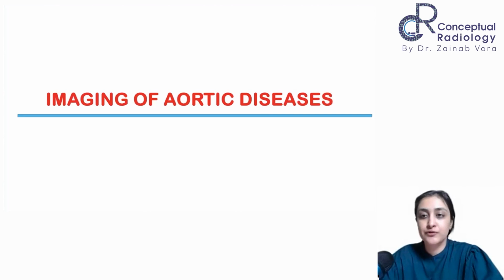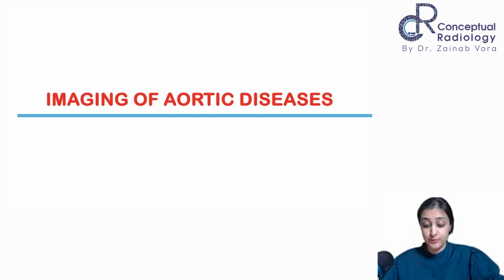So the domain of today's lecture is going to be mainly the imaging, and what we need to report in a case of dissection and in an aneurysm, and what the clinically relevant things are, right? So that's what I'm going to be discussing, and of course the protocol and a few things about endoleaks and stuff that we should have an idea about as a resident.